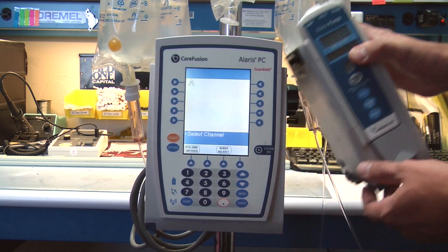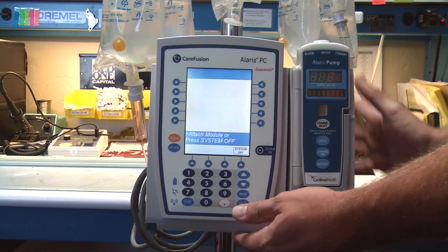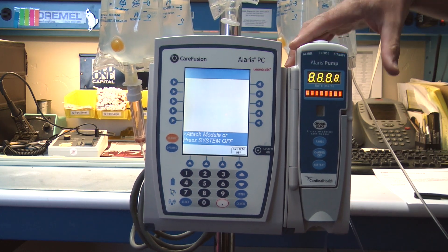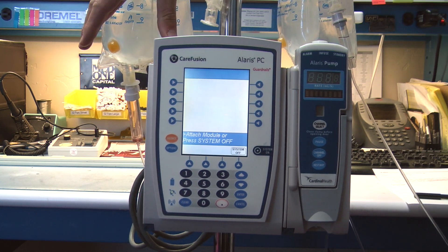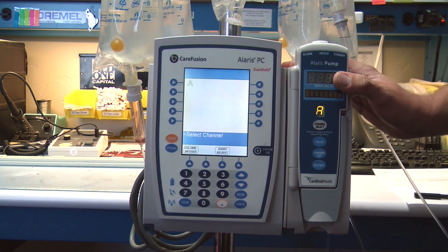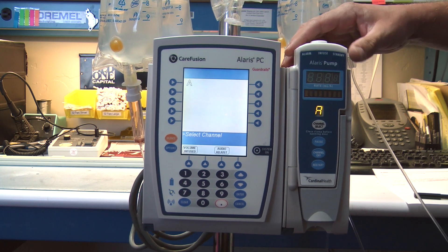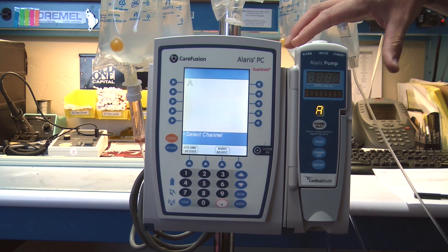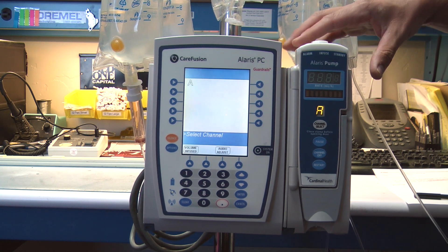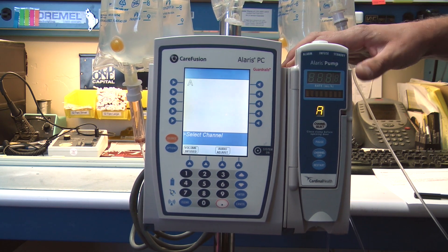You can actually disconnect and reconnect this pump very easily, and along with that you're able to connect two pumps on both sides, giving you a total of four infusion pumps to use with your PCU. Along with that, you're able to use in conjunction with your pump the syringe pump, the PCA pump, and the other modules that CareFusion provides.